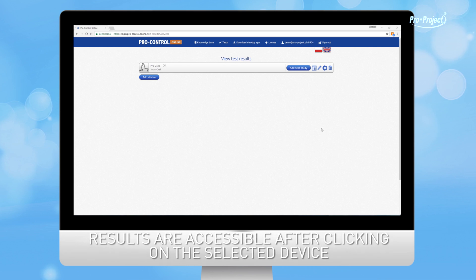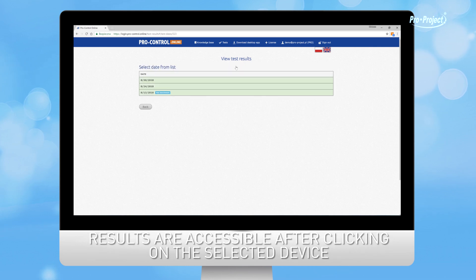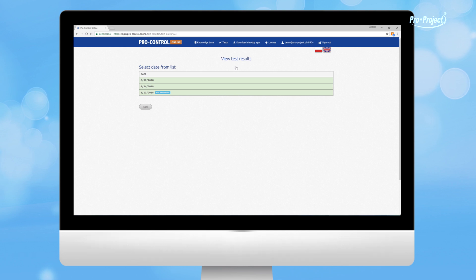The results are accessible after clicking on the selected device and then choosing the proper date. The color of the item on the list depicts the outcome of the tests for a given day. If it is green, all tests have been passed.